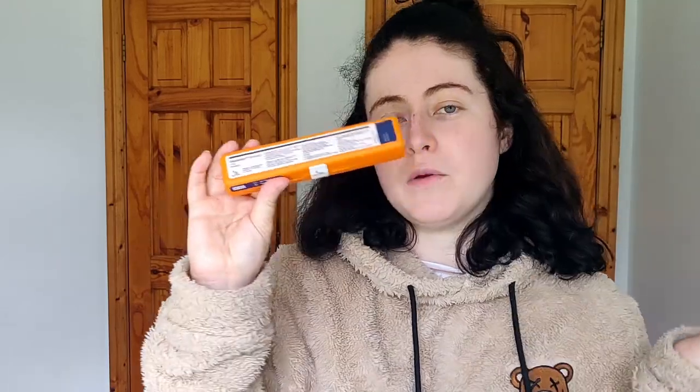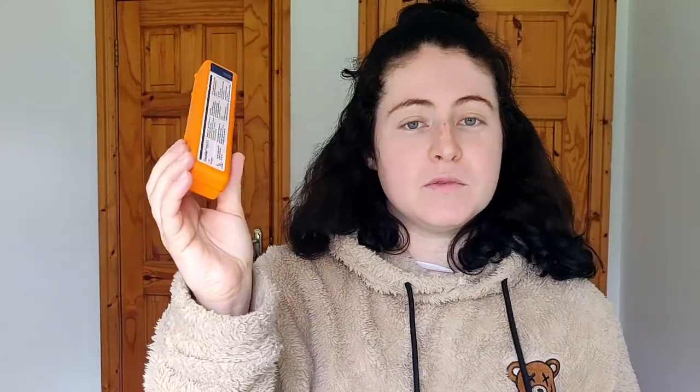If you are a type 1 diabetic, it's very important that people know that this glucagon hypokit exists so it can help you recover from an extreme low blood sugar and that people are aware of how to use it. And on the other side, if you are non-diabetic, you may need to use this on someone who is diabetic in your lifetime, so I think it's a really important video to put out there.